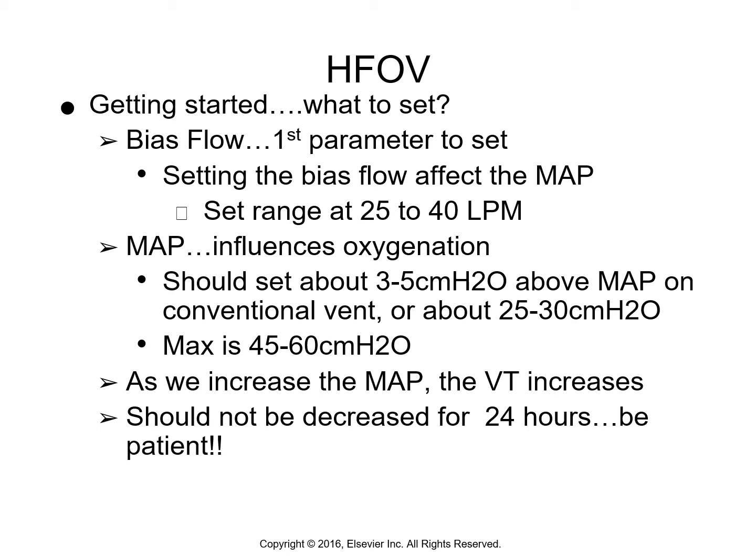So if the bias flow is set too high, it can dampen that active exhalation and only allow the gas to remove from the circuit. Then therefore you have an increased PaCO2 and it results in auto PEEP. So we don't want to do that.